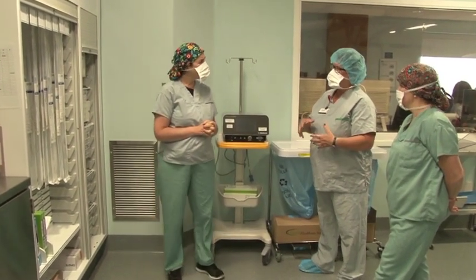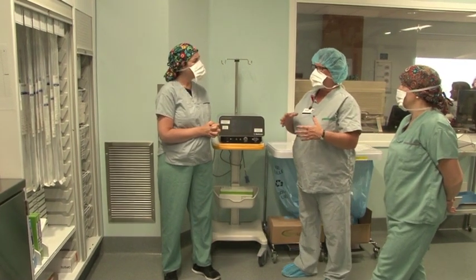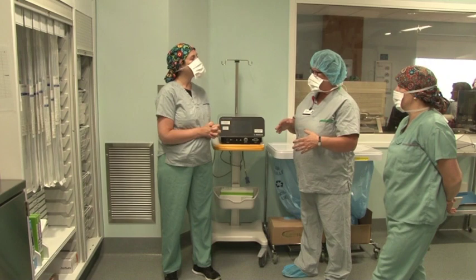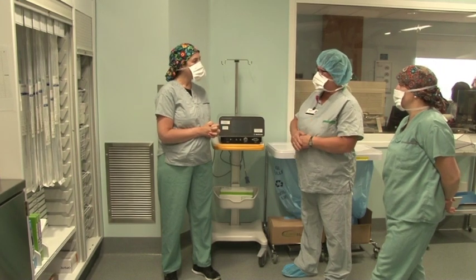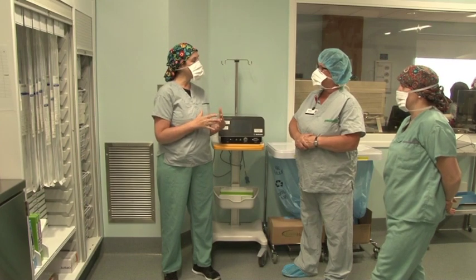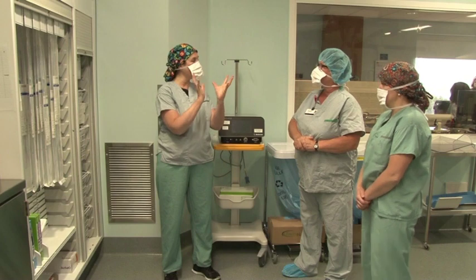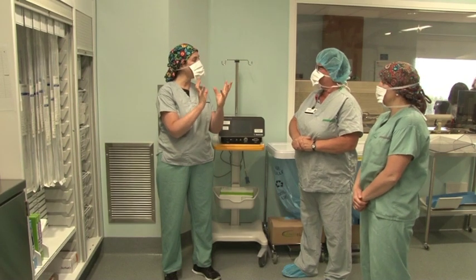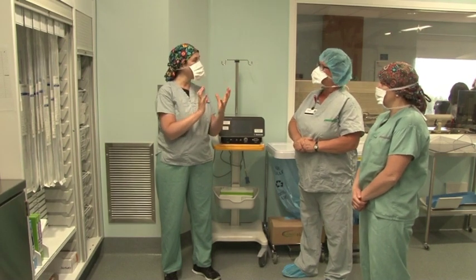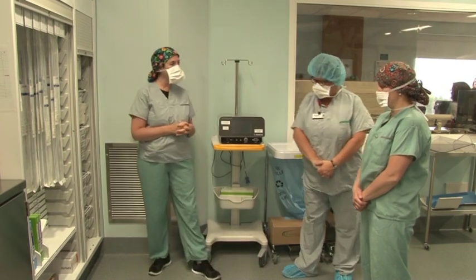So I hear people talk about getting CRT. Is that the same thing? Yes, that is the same thing as a CRT pacemaker or CRT ICD. There's synchronization again of the left ventricle with the right ventricle so that we can improve somebody's pumping of the heart. Oh, interesting. Thank you. Oh, you're very welcome.